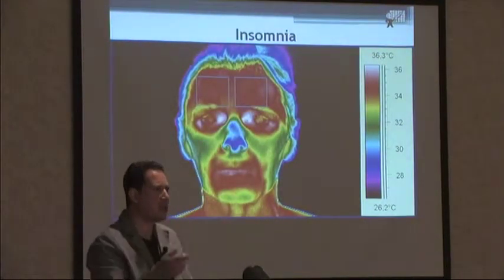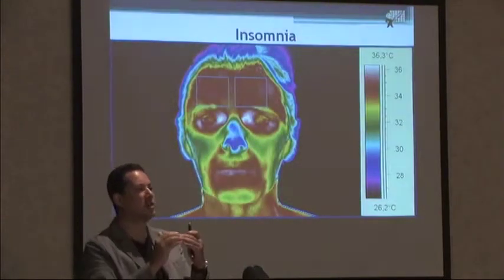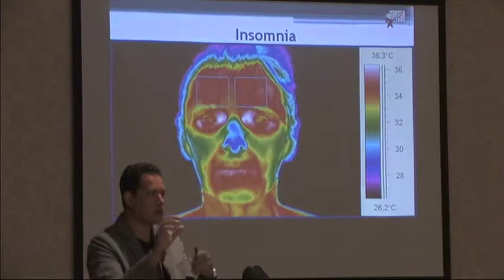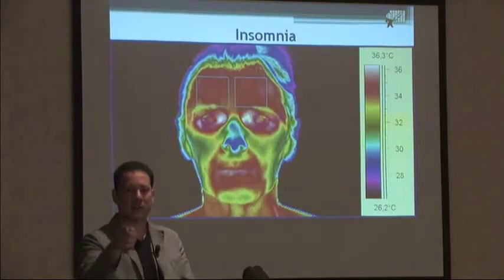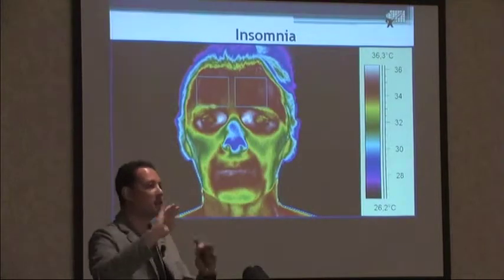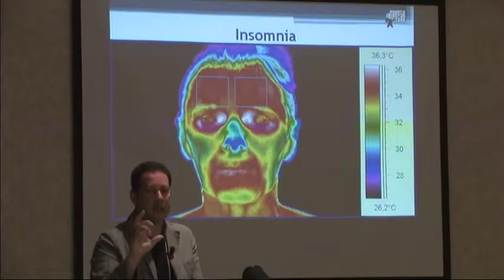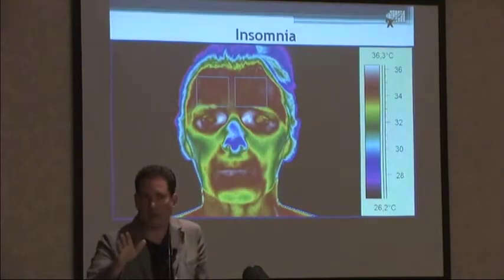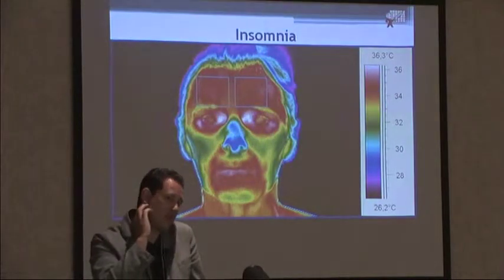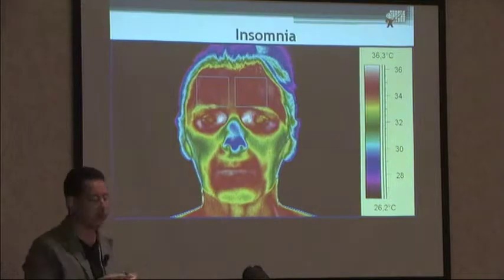But thermography is so much more sensitive for this, so if I have a camera here, I can say, oh, you didn't sleep tonight. It's very interesting. It's a screening method, and interesting to apply in traffic, in transit.